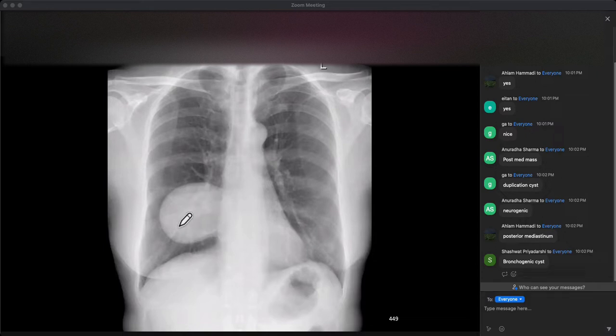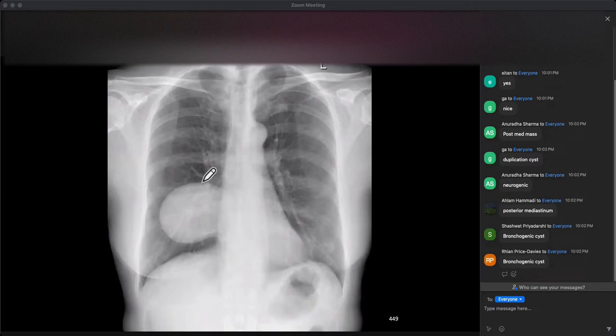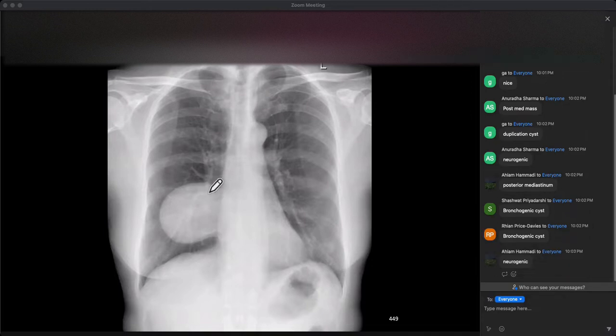And because I can see the blood vessels, it means it cannot be in the middle mediastinum, therefore it's in the posterior mediastinum. And if it's in the posterior mediastinum, it must therefore be a schwannoma because it's solitary. So even though I don't have any sophisticated MR or CT, I can work out just by a process of elimination that this must be a schwannoma.